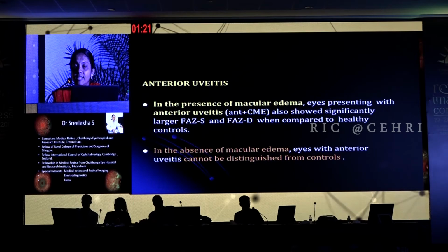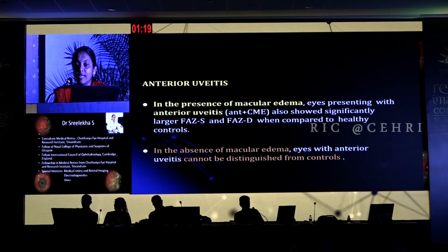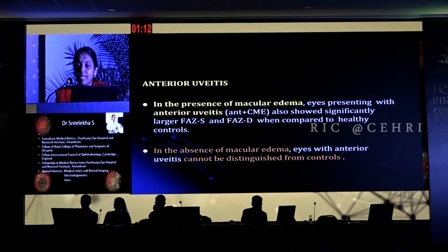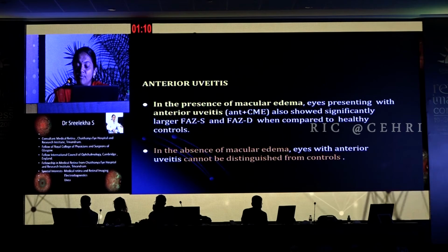Whereas in anterior uveitis, in the presence of macular edema, there was significant enlargement of the superficial as well as deep FAZ when compared to healthy controls. But in the absence of macular edema, eyes with anterior uveitis cannot be distinguished from controls.